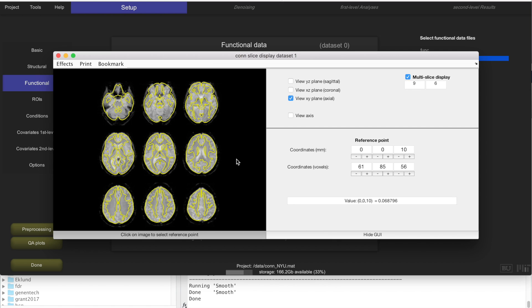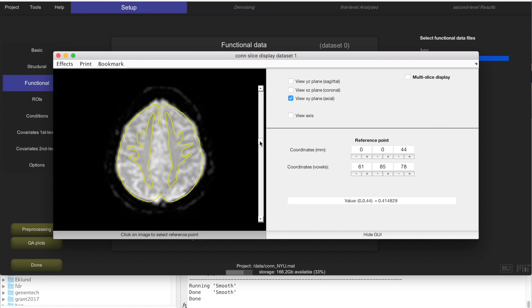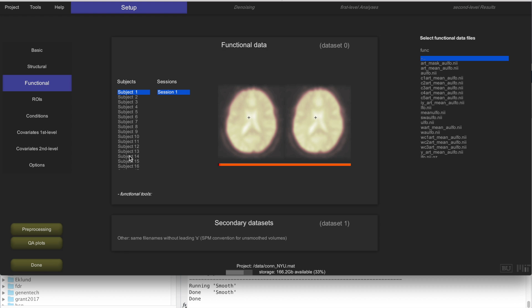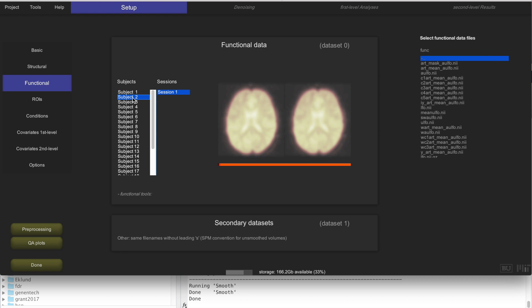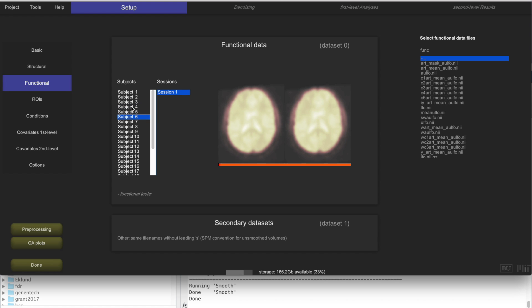MNI boundaries represent the 25% boundaries of where grey matter should be or would be expected to be if the brain was in MNI space. You should see a reasonably good match between the MNI boundaries of the brain and the actual functional data after normalization. You can repeat all of these plots for every subject — the quality assurance plots allow you to create and evaluate them in a simpler manner.